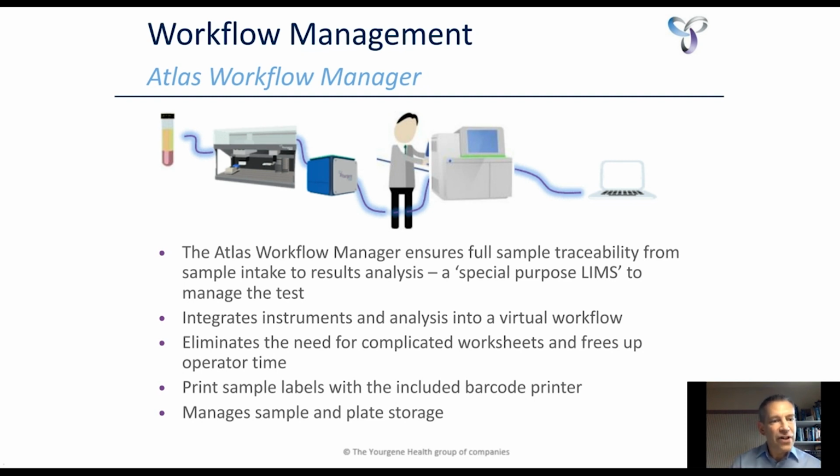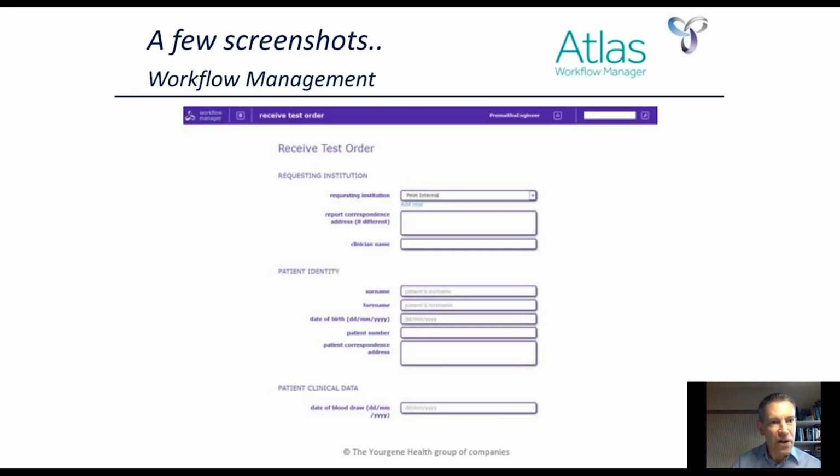And just to finish off, I've got a few little screenshots that I'll run through very quickly. Firstly, on the workflow management front, I know it's not the easiest thing to read, but hopefully you can get a feel for it. The Atlas Workflow Manager input. This is one of the input screens. On this particular system we have a theme loaded that makes the system look a certain way. It's using our house colors here.